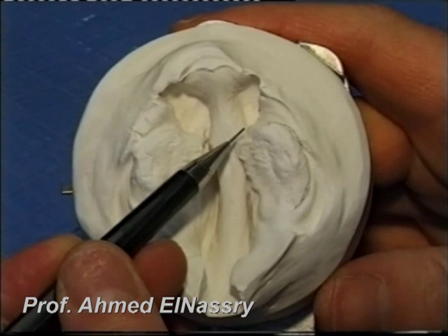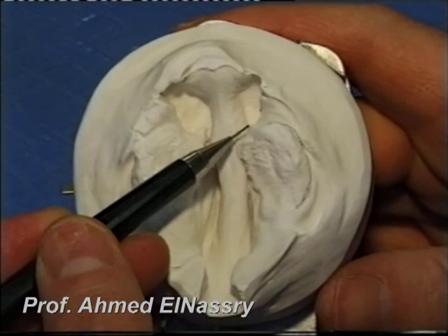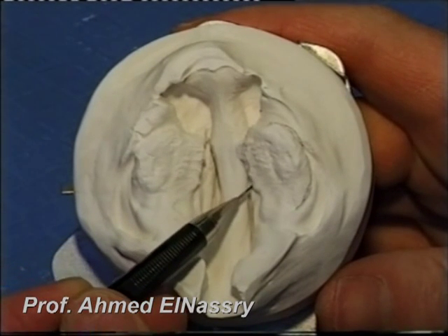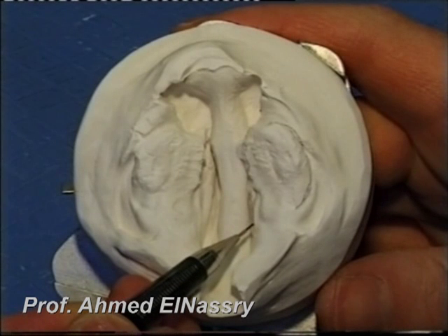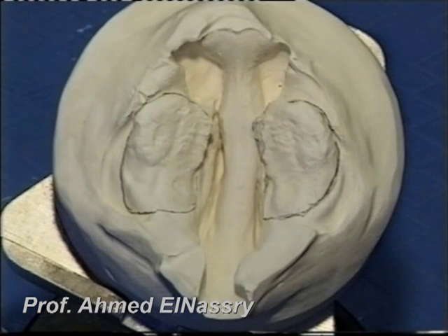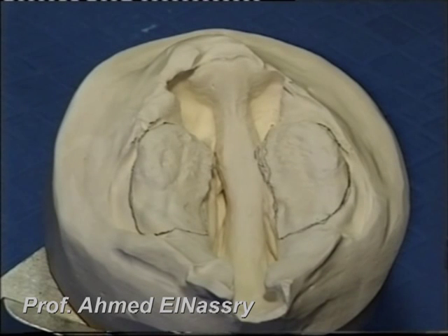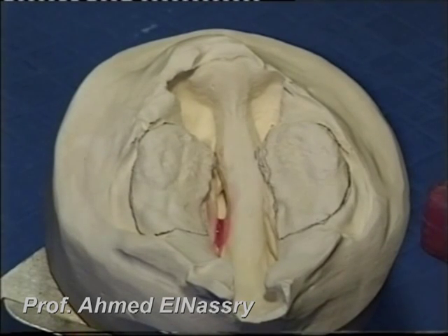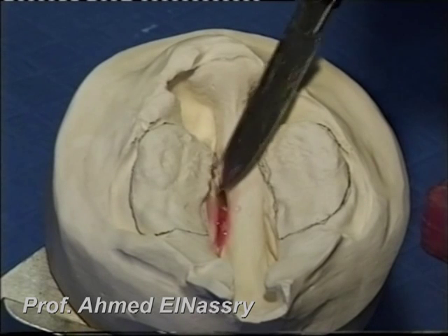The first step of the construction is to outline the two maxillary portions. The second step is to block out the undercut areas in the model with wax.